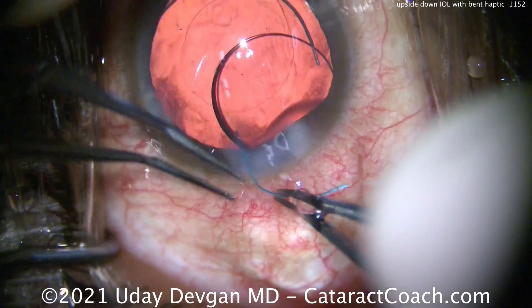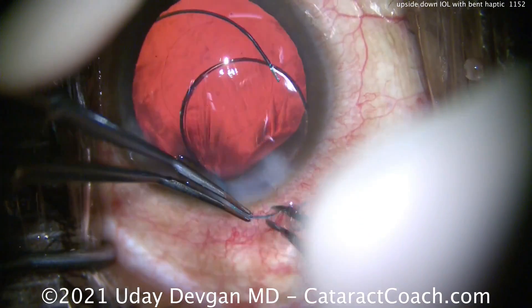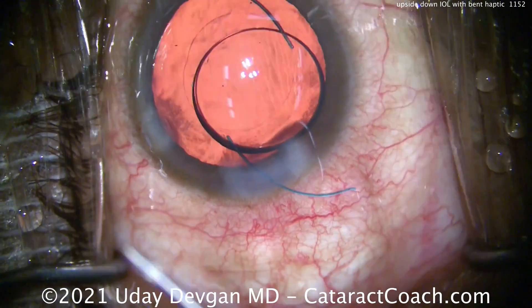Put the haptic in the sulcus and capture the optic behind the rhexis — that keeps it stable. But instead, let's fill with viscoelastic, take the haptic outside the eye, straighten it out, and this will make it a whole lot better.